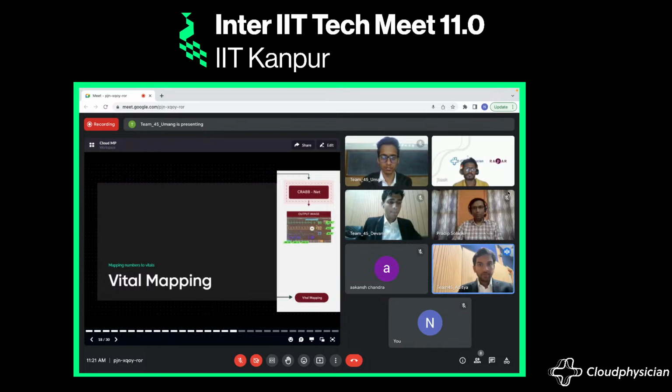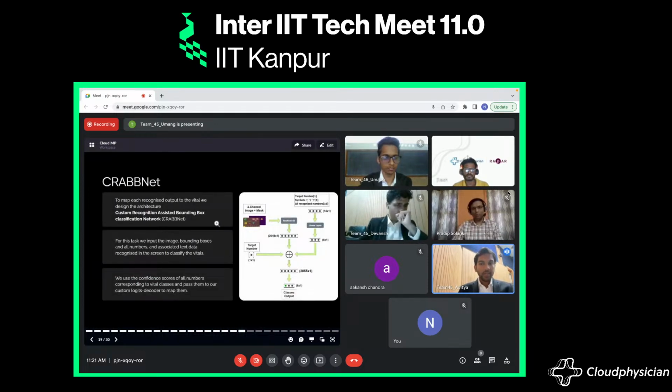Okay, so now that we have found all the numbers on the screen, detected and read them, we need to classify each recognized number to a vital. Here, each vital is one class. For this task, we need a model that takes the image, all the bounding boxes, the numbers to be classified, and all other recognized numbers on the screen as input. To use all of this information simultaneously, we created our custom architecture called CrabNet.